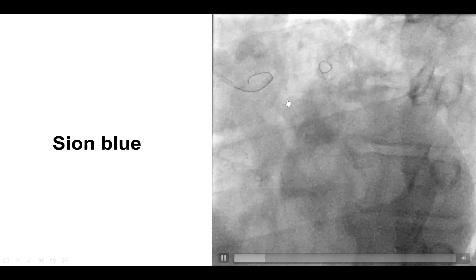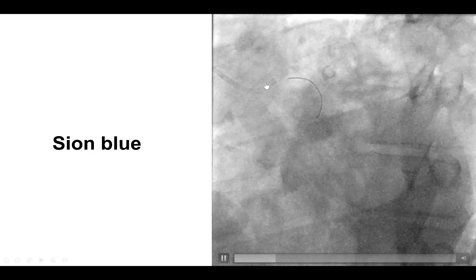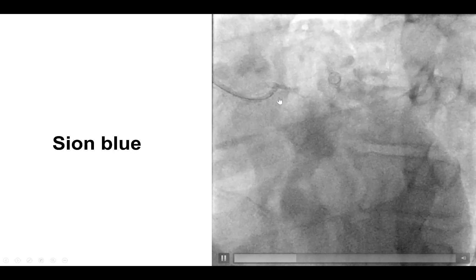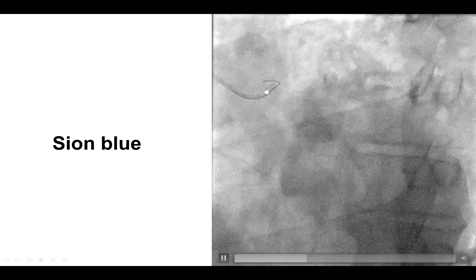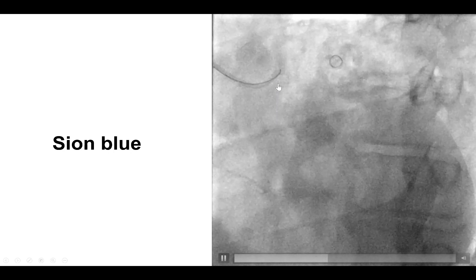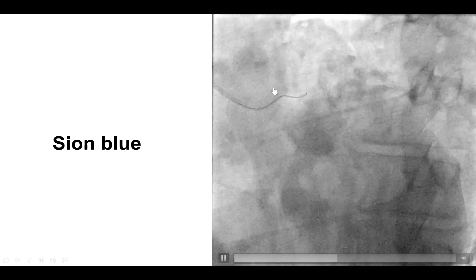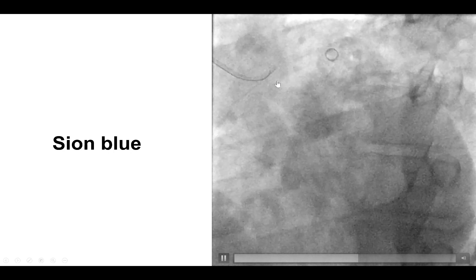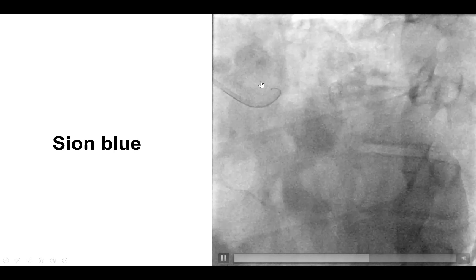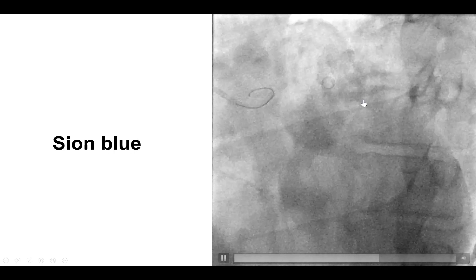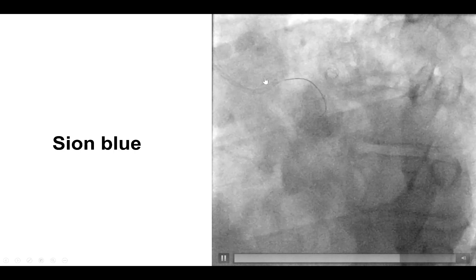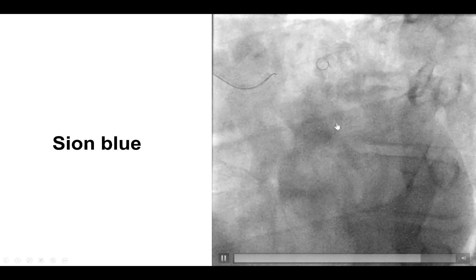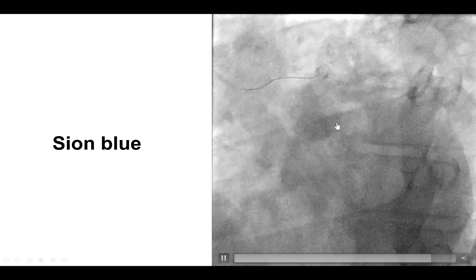This is a workhorse Sion Blue guide wire that did enter into the anomalous right coronary artery, but there was not enough support and the wire kept prolapsing back into the aorta. We made some progress, but once again the wire would prolapse back.